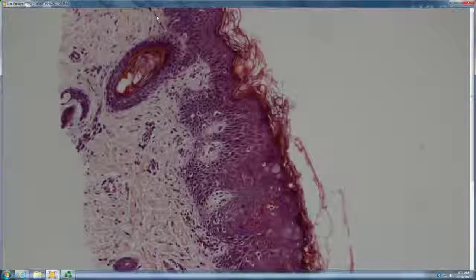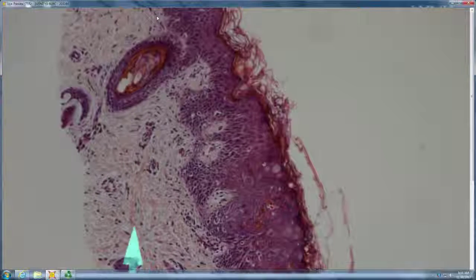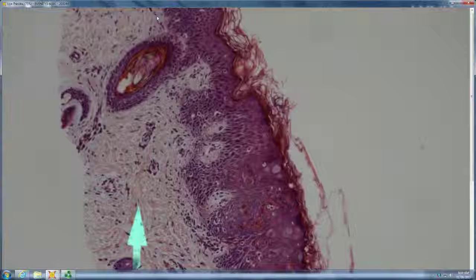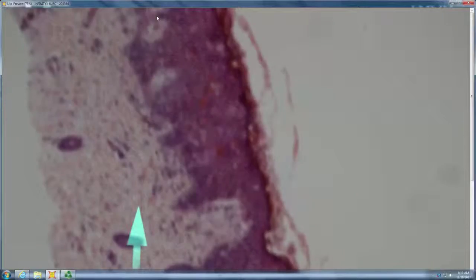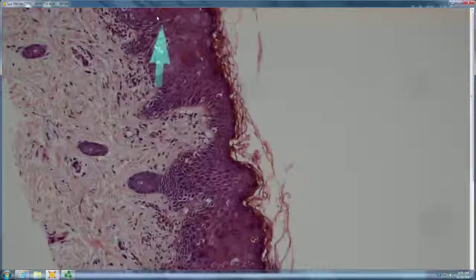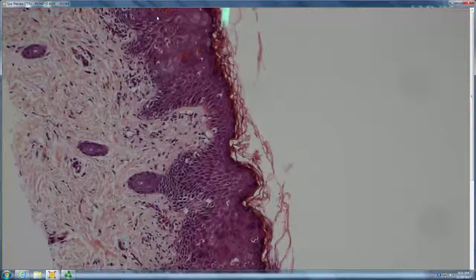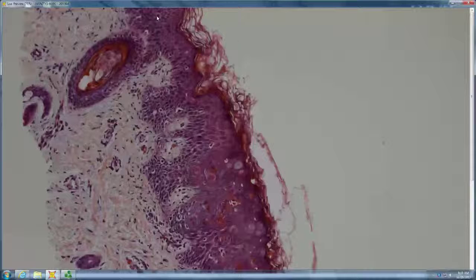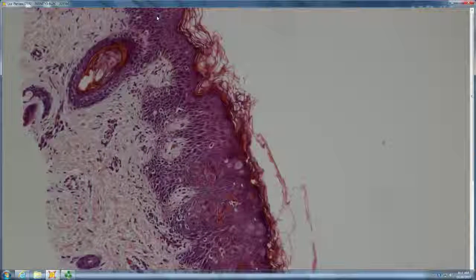That was easy. So you have, first off, very delicate, pretty dark red staining collagen with a lot of fibroblasts. That's baby skin. So kid skin or baby skin. And lots of dead reds, and those dead reds can move up into the corneum as little whorls sometimes. We're not seeing many of them yet. That's the verruca stage of IP.